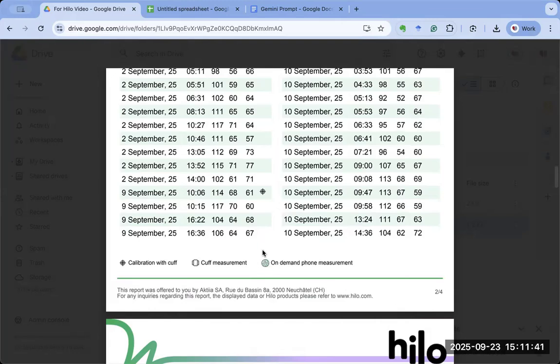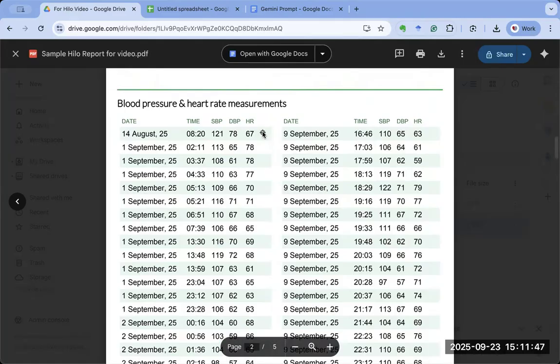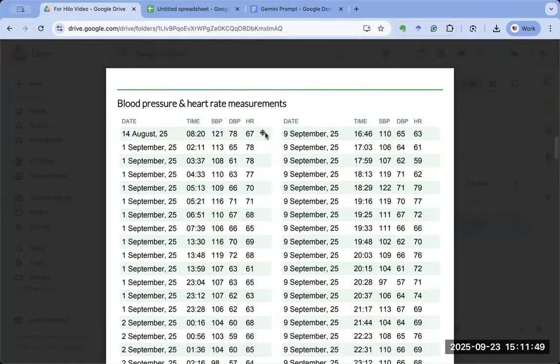I'm not very sure. One point I want to highlight here is, though the app recommends that we calibrate once in 30 days, if you calibrate more often, and the app suggests that as well, the accuracy is improved.